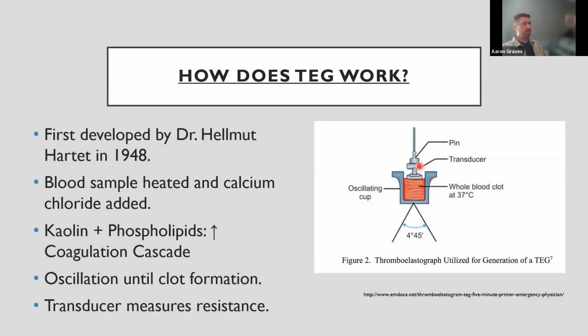So in terms of how a TEG actually works. It was developed some time ago, 1948, by Dr. Hellmut Hartert, and it was actually used briefly in Vietnam and has come back into service in terms of its usefulness in trauma patients in the last, I think, 20 or 30 years.